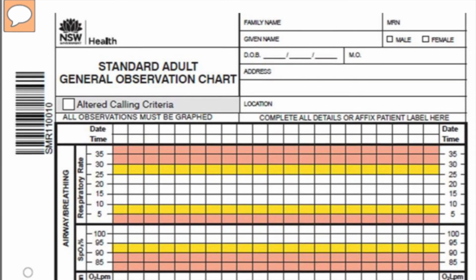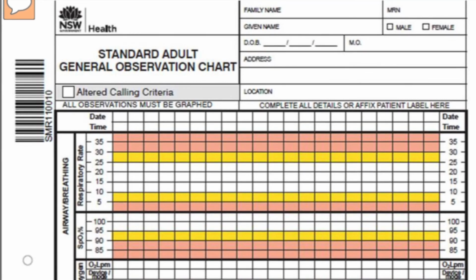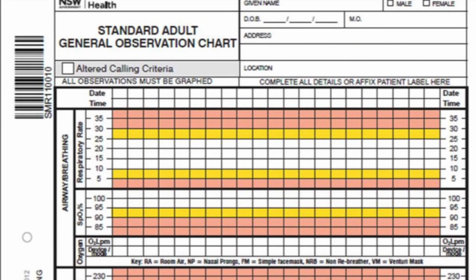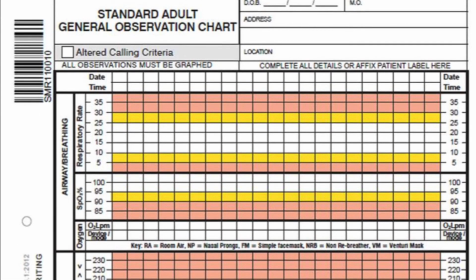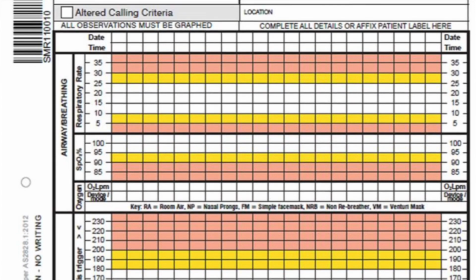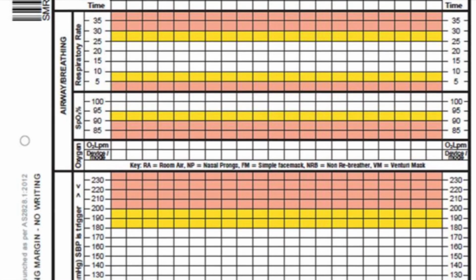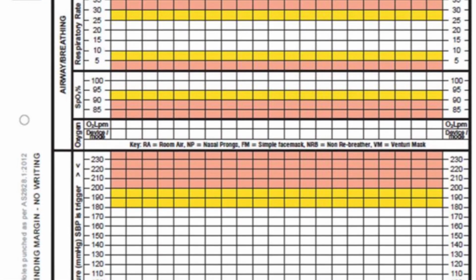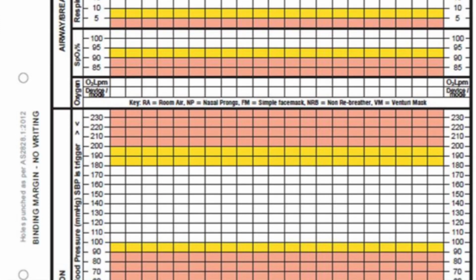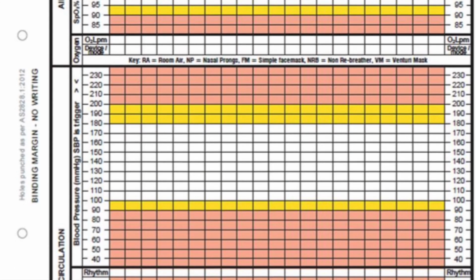And finally, as we are in the process of transporting this patient, you want to make sure that you're documenting any changes to patient condition. You want to note how much fluid is draining by the hour, the colour, the consistency, if there is the presence of bubbles at any stage, what you did to fix that, and what the cause was identified to be. You want to make sure that the swing is consistent with what you'd expect, and document also any issues that the patient may have in regards to pain or respiratory compromise secondary to problems with drainage.